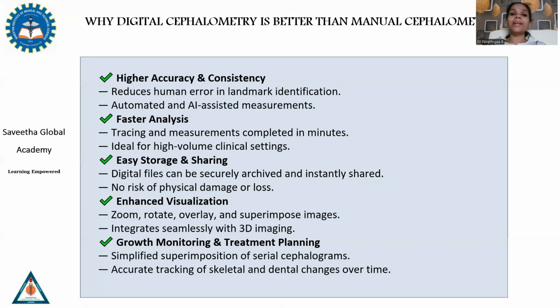Also, it provides an enhanced visualization wherein you can identify the soft tissue and the hard tissue features more accurately by changing the brightness and contrast of the radiographs. Also, it helps us in growth monitoring and treatment planning in a three-dimensional aspect as well by providing simplified superimposition in the software and accurate tracking of skeletal and dental changes over time.